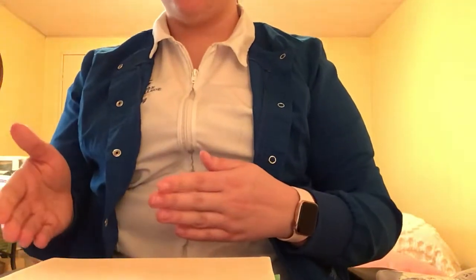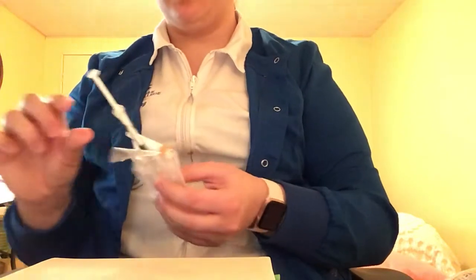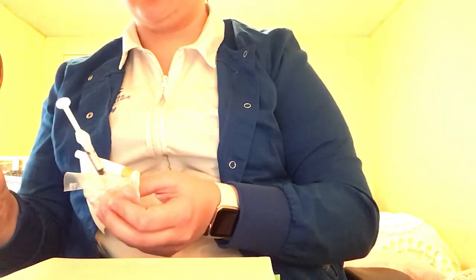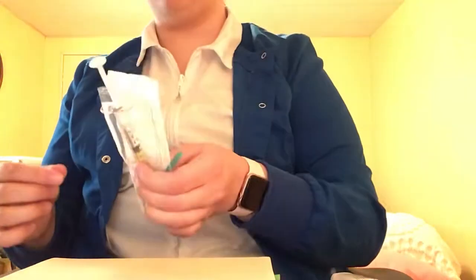And now I'm going to perform my second set of rights. So I'm going to verify that this is for Anna Powolowski. Her date of birth is May 5th, 1957. She has an allergy to penicillin, and her reaction is hives. And for the first one, this is her B12 injection, and I could tell that from the label. It is 500 micrograms for the dose. The route is subcutaneous, and the time is 16:20. And I'm going to do that same thing with the influenza vaccine.